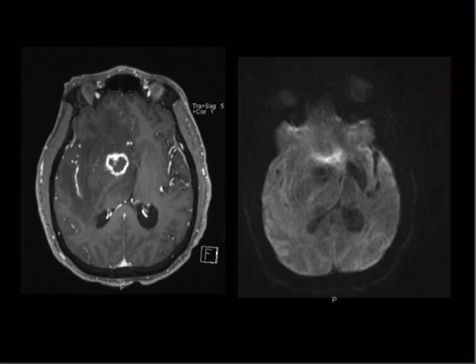So in your head, you should have a list of stuff that restricts. So stroke restricts, certain infections restrict, and a bunch of hypercellular tumors restrict. Which ones? Classic ones: lymphoma, GBM, and medulloblastoma that are hypercellular can do it too. For the purpose of multiple choice, it's lymphoma. Acute demyelinating lesions can restrict diffusion. So remember MS plaques, when they're acute, they can restrict diffusion. Certain infections like herpes encephalitis classically will restrict diffusion. CJD can restrict diffusion. Then you can have fake outs like T2 shine through, those kinds of things too.